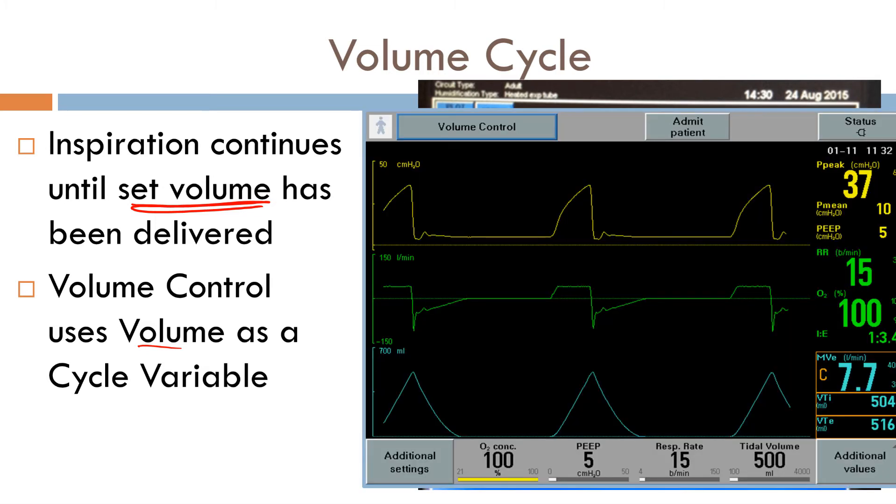So let's take a look at this. Here we can see we're in volume control as well. And our cycle variable is here, 500 cc. So once 500 hits here, it stops delivering your breath. So in volume control ventilation, the cycle variable is volume.